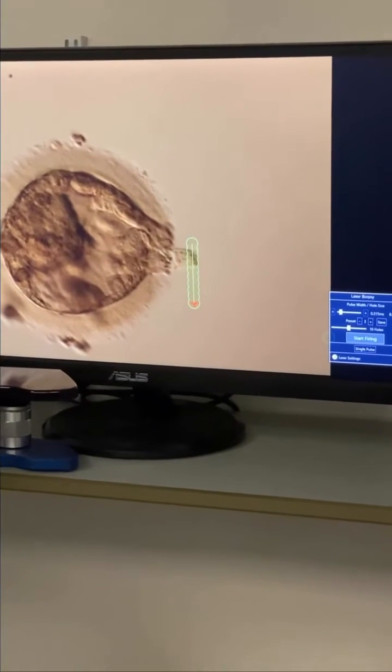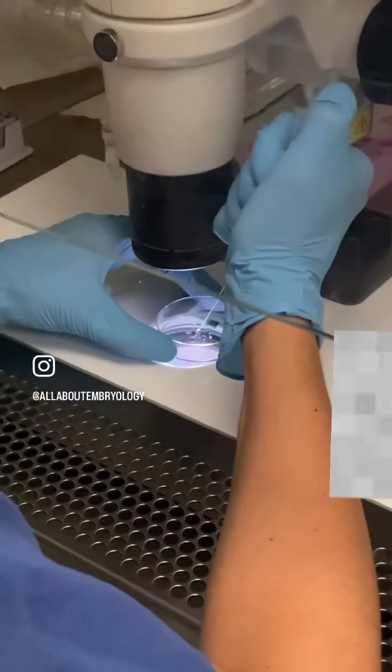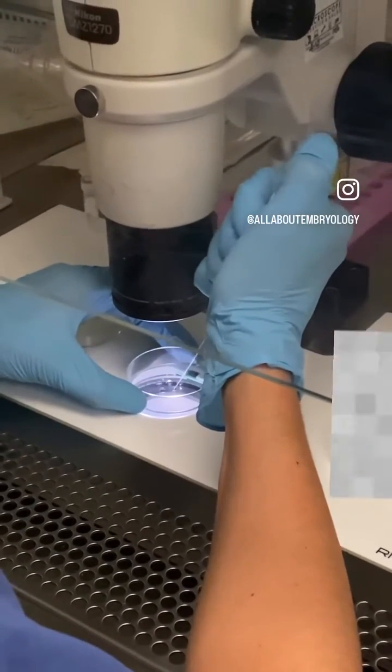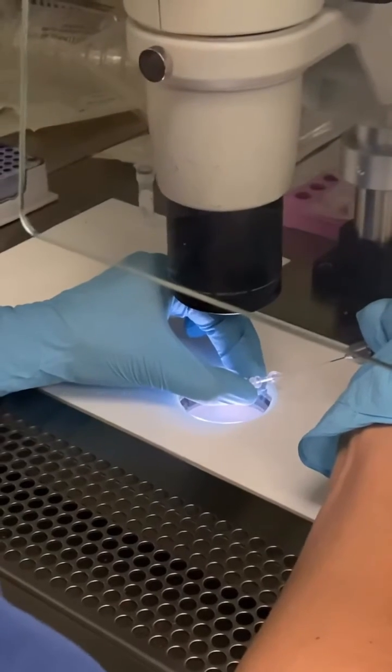Ideally a clump of approximately five cells will be removed. These cells are then thoroughly washed in a buffer solution and placed into a small tube which can be sent away to the genetics laboratory for testing. The biopsied blastocyst is then frozen and the patients will wait for the results.